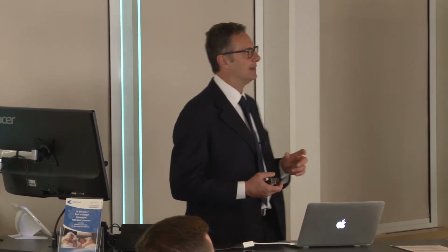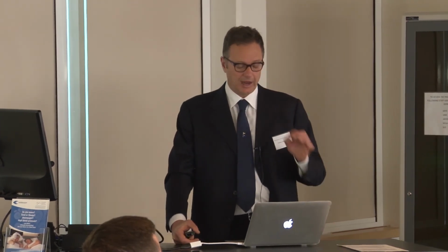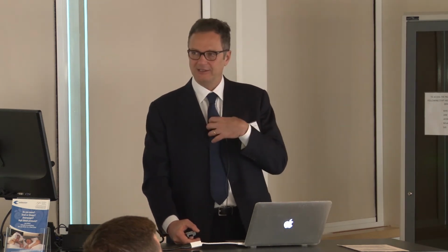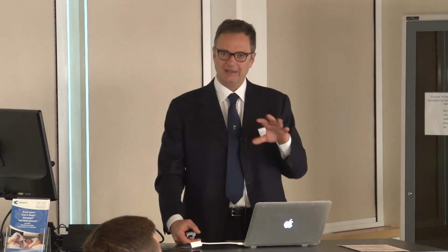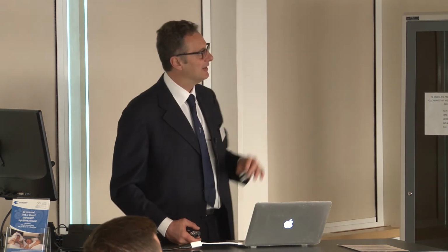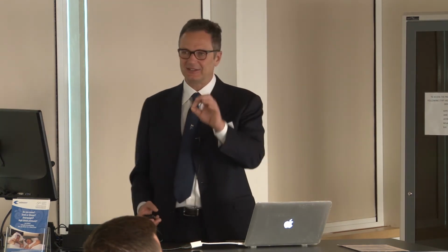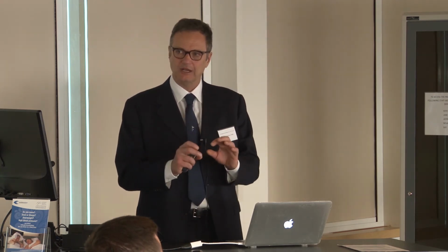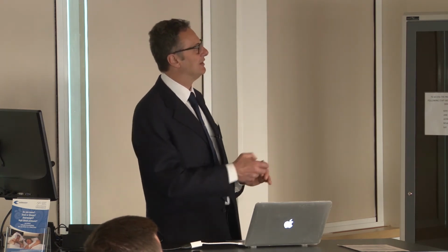So you have to be very careful when the anesthesiologist intubates the patient. I prefer to intubate the patient myself to avoid any bleeding during the intubation. Also, when the residents start to perform the endoscopy, I always suggest to be very careful: don't touch the lesion. You have to go very close to the lesion, but don't touch it, because if you have bleeding, you have to stop your examination.